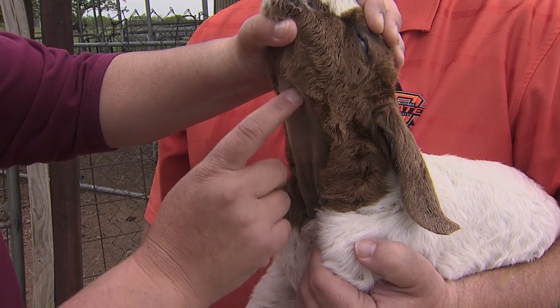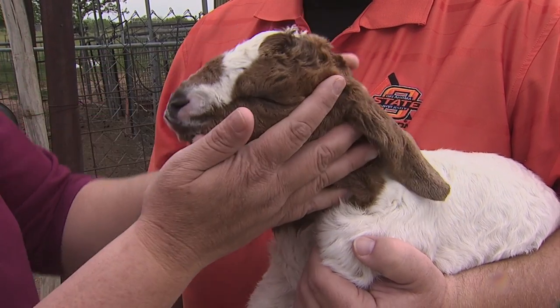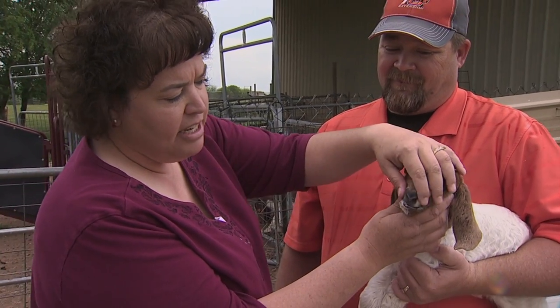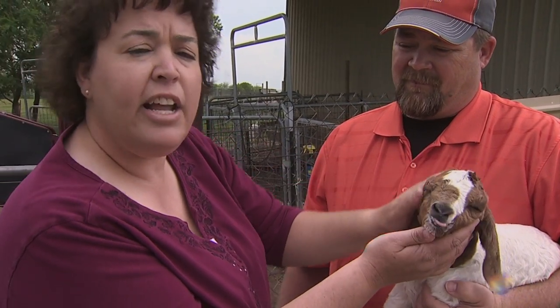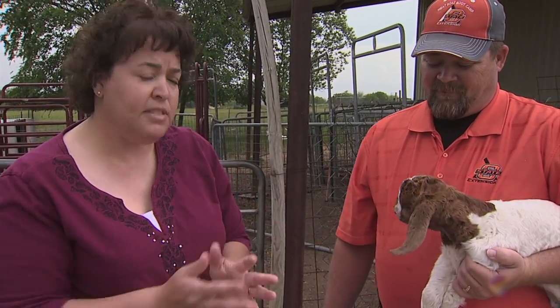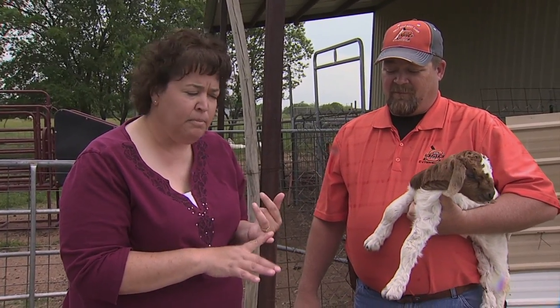Unless your goat is deformed, that did not hurt her one bit — she's a little upset because she didn't get to suck on it. She's got a bad lip that she's learning how to use, and that's another reason you would tube one: if they have some issues and they can't figure out how to suck, or moms have refused them. It's just a very helpful tool to know how to do.